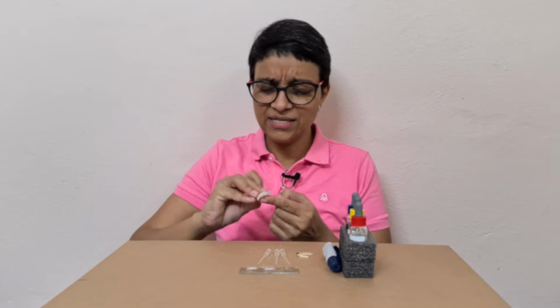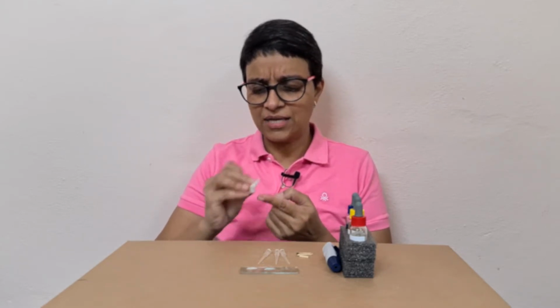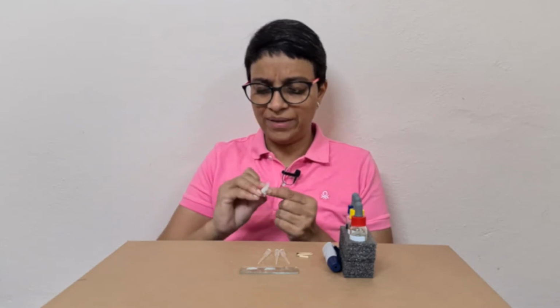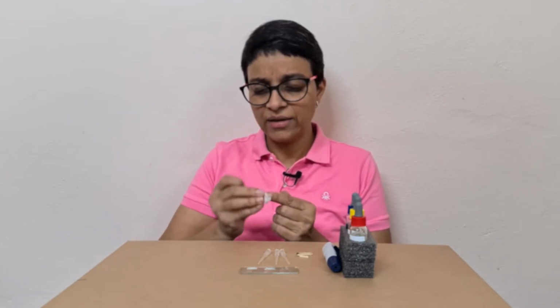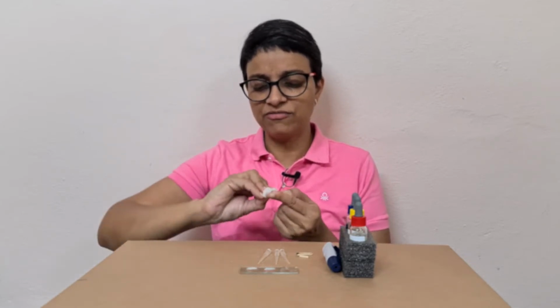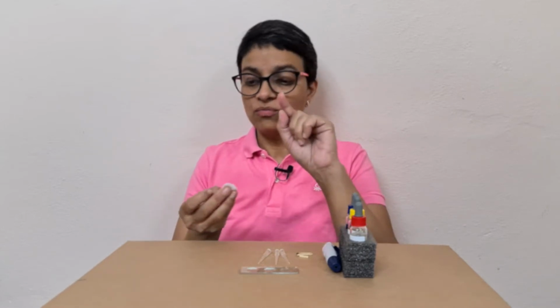They are proteins, right? They are antigens. We are saying they are antigens type A and type B. What is it that makes them A or B? How does the protein or the antigen differ in individual A and individual B? So I cleaned my finger quite neat.